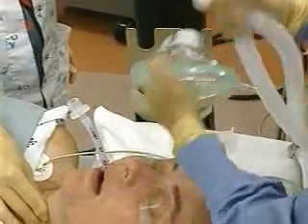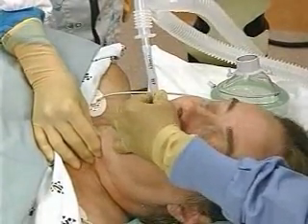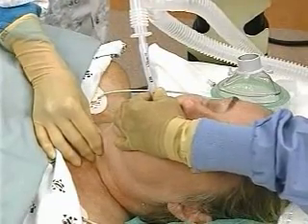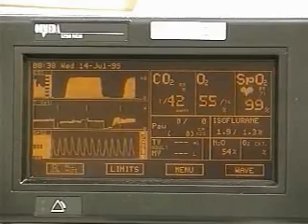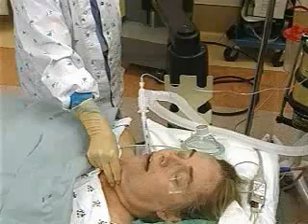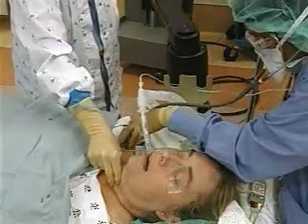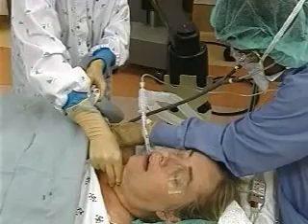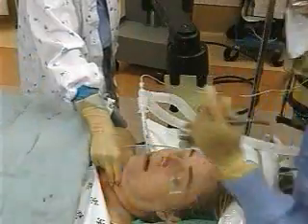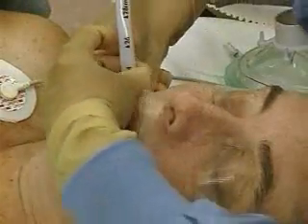Place an end-tidal CO2 monitor in the breathing circuit between the tube adapter and the ventilator bag. Gently give several breaths and watch the chest for expansion. Check a minimum of six breaths for measurement of CO2 on the CO2 monitor; this ensures that CO2 returning to the breathing circuit has a pulmonary source and is not insufflated air from the stomach. Listen for bilateral breath sounds over the chest and for an absence of sounds over the gastric area. If all clinical signs point to intubation of the trachea, the assistant may then release the cricoid pressure.